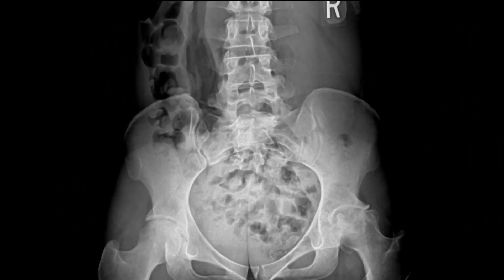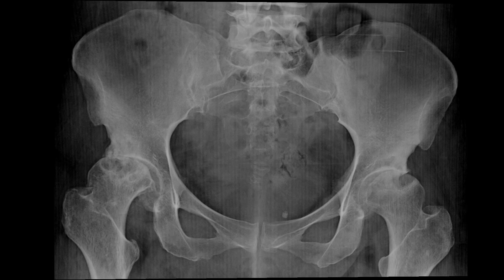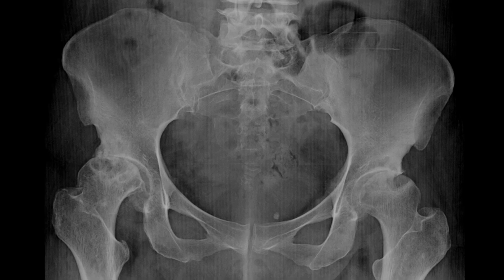This is a younger individual with a history of trauma showing significant degenerative changes, as well as flattening, deformity, subchondral cyst formation, and a likely underlying subchondral fracture of that femoral head. Here's one last example of bilateral AVN with very large subchondral cyst formation and severe arthrosis of the femoroacetabular joints.